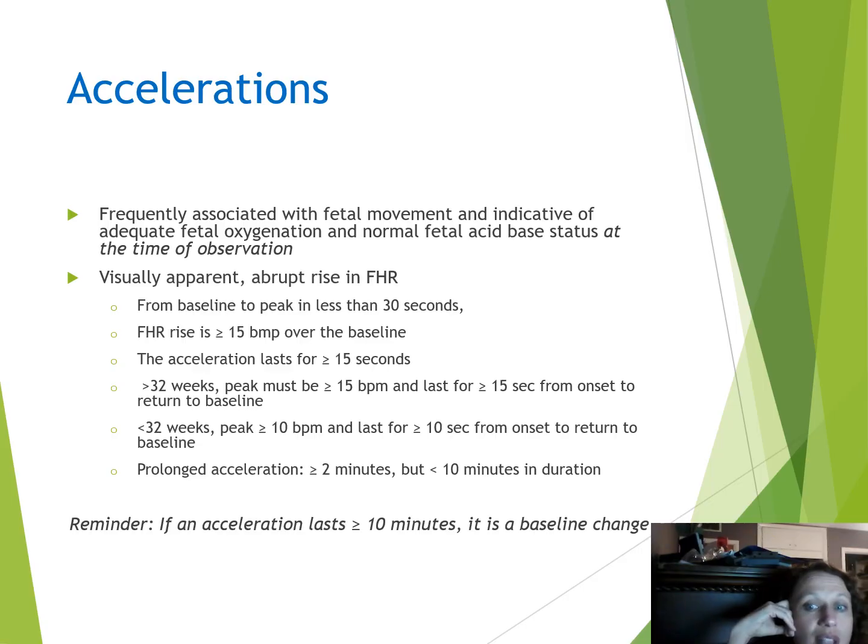Now, if your acceleration lasts longer than 2 minutes, it's not just a normal acceleration now, it's prolonged. It's prolonged acceleration. It doesn't really mean anything. What it does mean, though, is now I'm watching that acceleration, because when will it become a new baseline? Once it goes over 10 minutes. So if you have it over a 10-minute period, then it becomes a completely new baseline.